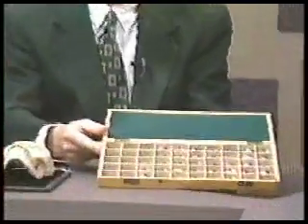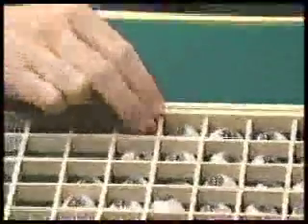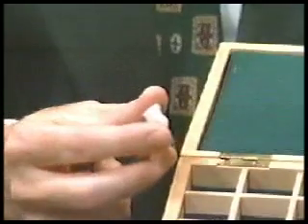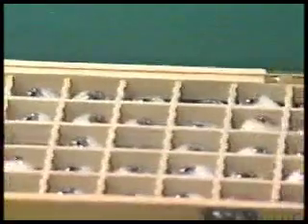Now, we also mentioned that you make them, but in the old days, tell us how they used to do this when I'd send a patient in that needed a, quote, glass eye or a false eye. Well, years ago, just because of the techniques of eyes and the way they're made, they'd be stock eyes, and what you would do is go into either a jeweler or some opticians, they'd have these already assembled, and they would just try them in until they got an approximate size and color. A lot of times it wasn't that great of a cosmetic match, but it was the best they had in those days. Today we custom make them for each individual patient, and we hand paint them.